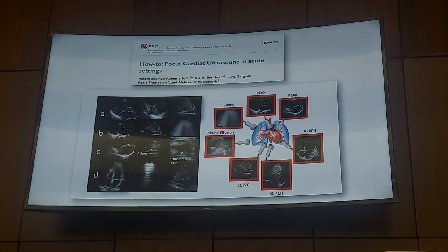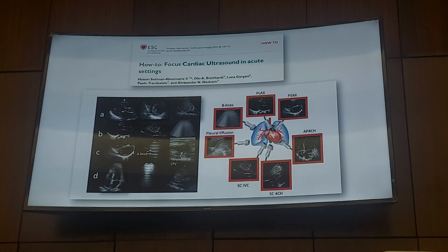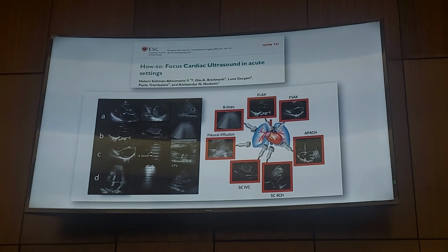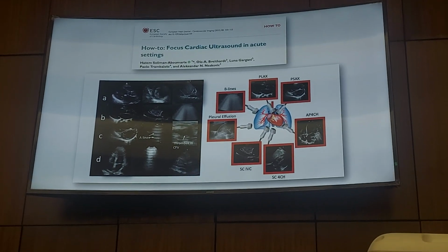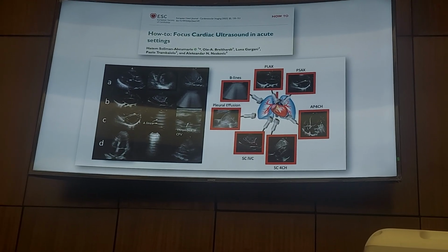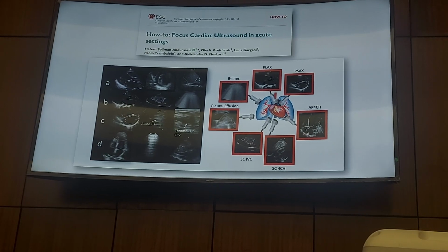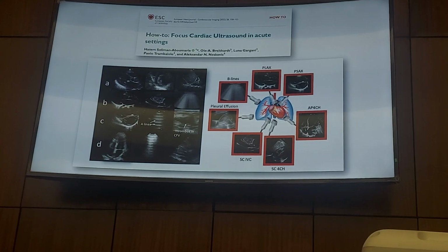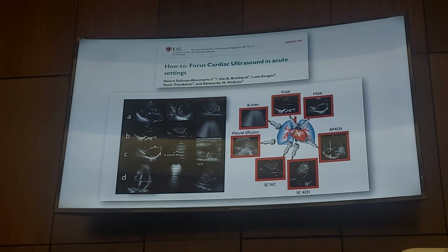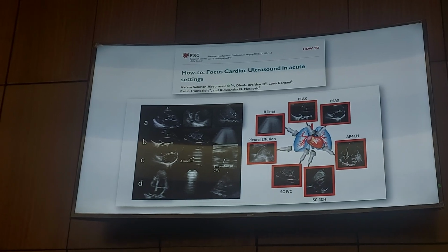And finally, we always recommend integrating lung with cardiac ultrasound. We described here four types of shock, where you had both cardiac and lung ultrasound. At the top, you have septic shock with vegetations in the aortic valve, vasodilatation, vasoplegia with hyperdynamic LV, preserved LV end-diastolic volume, and a small IVC. Panel B was a patient with cardiogenic shock who had severely impaired left ventricular function, a dilated IVC and bilateral coalescent B lines. Panel C was a patient with obstructive shock who had dilated RV with flattened interventricular septum.